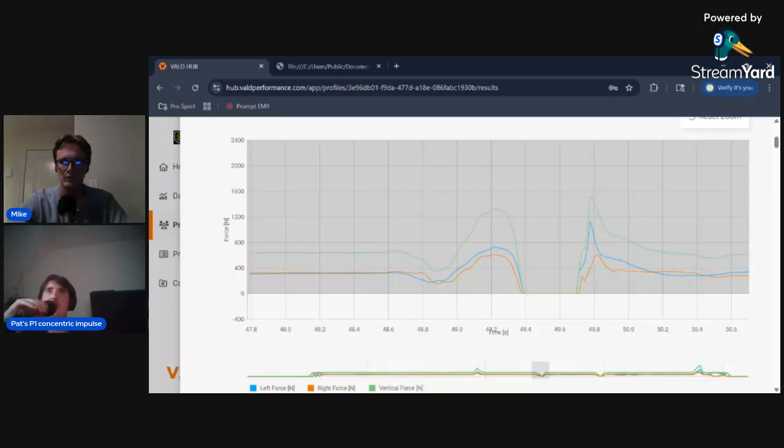And I think a big part of that also is the first metric I would probably look at is that eccentric peak velocity. I would want to see, does that change first? Does she want to go to the floor faster and actually produce force faster because she's dropping faster? That is the one that I would want to see first before we start seeing all the other results, such as peak force at zero velocity, eccentric peak force, all those, because those are all just going to be products of the steps leading up to it.